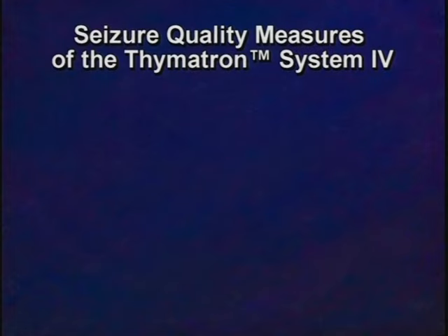The Thymatron System IV is shipped with 6 seizure quality measures already enabled.